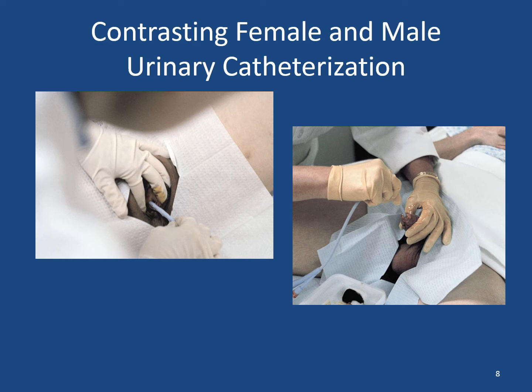Once you place that catheter, you keep going until you see urine in the tubing. You go a little bit further, and then you know that when you're inflating that balloon, it's going to be inflated in the bladder, not in the urethra. You don't want to blow up the balloon in the urethra. You will cause significant damage and pain to your client.